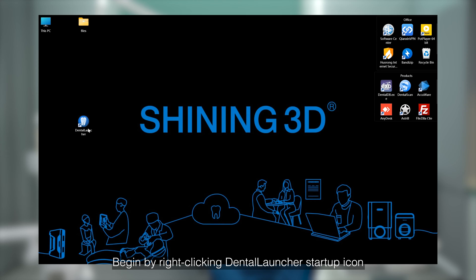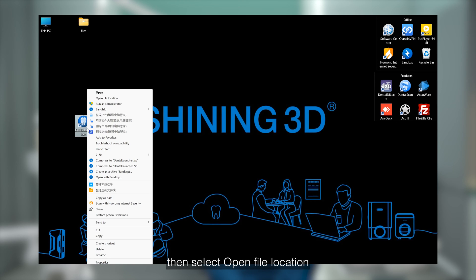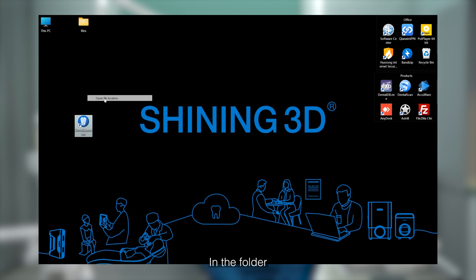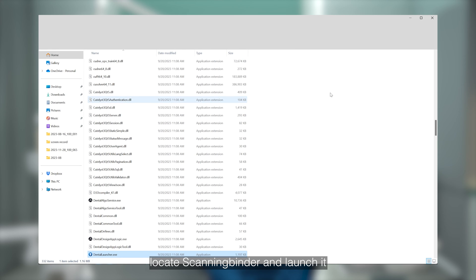Begin by right-clicking the Dental Launcher Startup icon, then select open file location. In the folder, locate ScanBinder and then launch it.